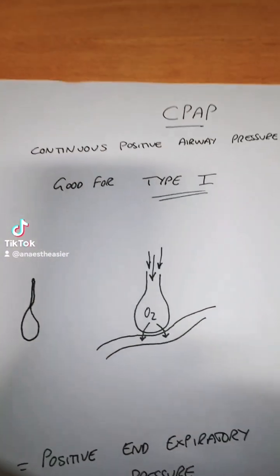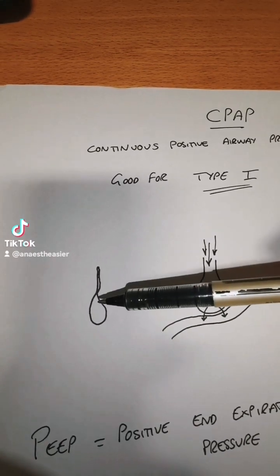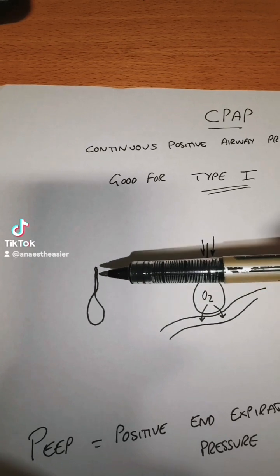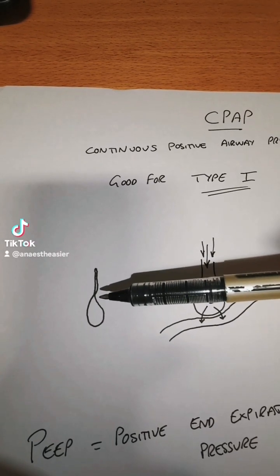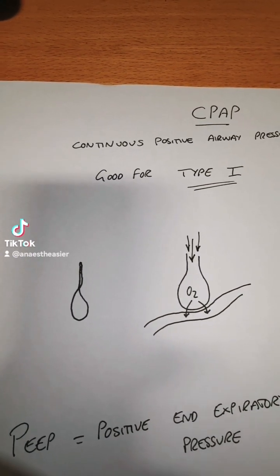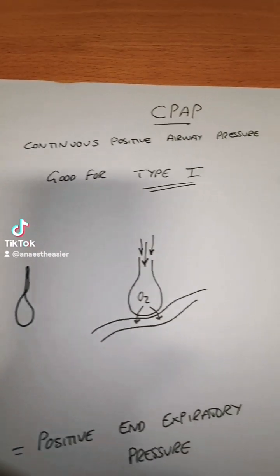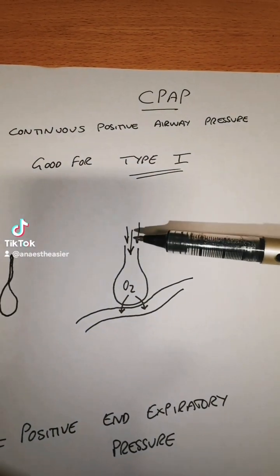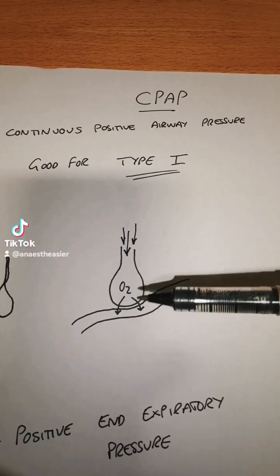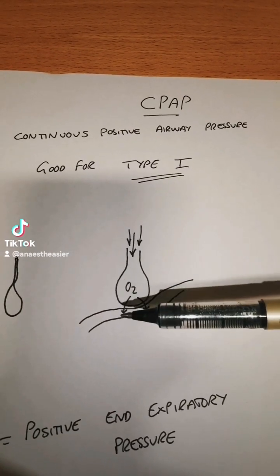So what's going on? If you take a balloon, just a normal balloon, and let it exhale completely, the balloon tends to flop shut. Your alveolus is the same. Because of the elastic tension in the wall, they often collapse if they're allowed to fully deflate. If, however, you pinch the balloon off just before it finishes deflating, it's got some positive pressure inside it which will hold it open. This alveolus is exactly the same. If you have some gentle continuous pressure during inhalation and exhalation, you hold that alveolus open and you provide more opportunity for oxygen to dissolve across from the alveolus into the blood.